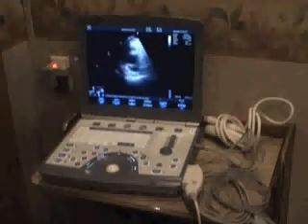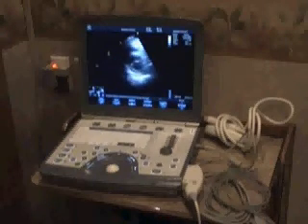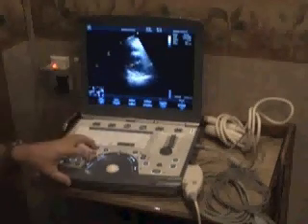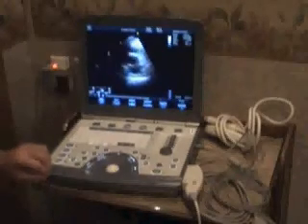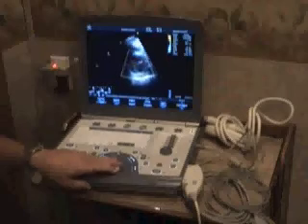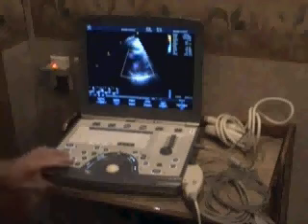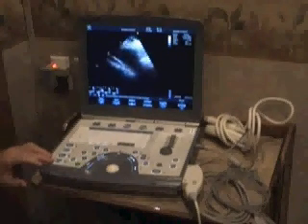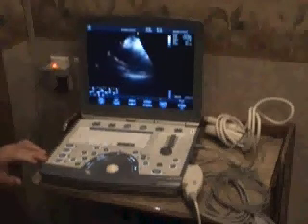After that's done, we're going to pan down and give you a picture of what's called the mitral valve. You'll see the LV and the mitral valve opening and closing. We are going to put color on that valve and take a picture. Then we're going to pan down and actually attempt to show the left ventricle itself without the valve in the image.